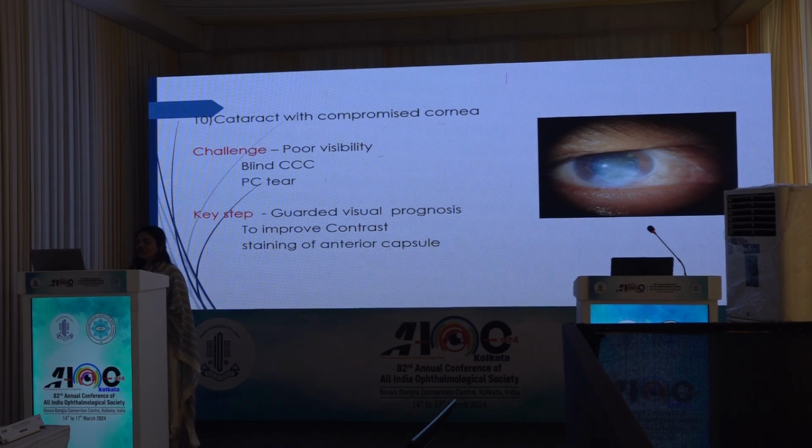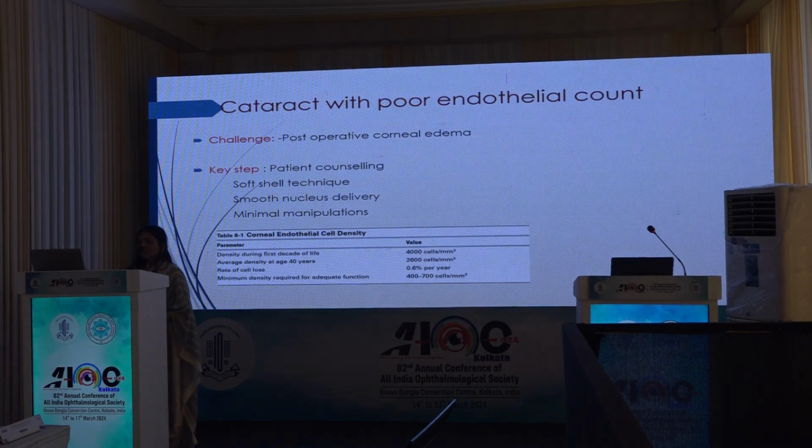PC tear can be there because visibility is very poor. So here we have to again counsel the patient for guarded visual prognosis. To improve the contrast, we should keep the dye for a longer time. And in cases of cataracts with poor endothelial count, the challenge here is post-operative corneal edema. So we should counsel the patient that they might need a corneal transplant surgery.